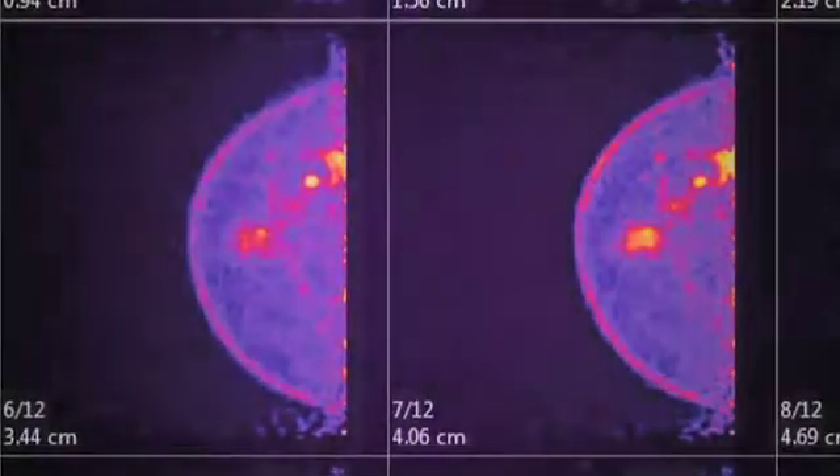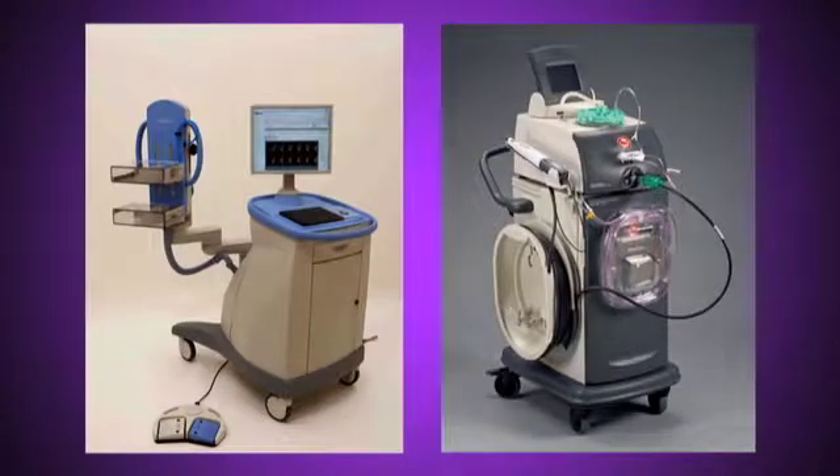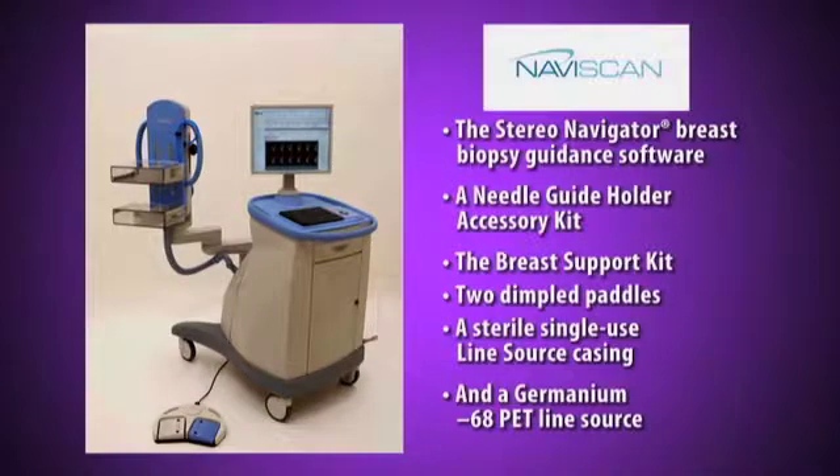To perform an image-guided breast biopsy with PEM, two sets of components are used: the PEM imaging components and the Mamatome breast biopsy components. The PEM components consist of the StereoNavigator breast biopsy guidance software, a needle guide holder accessory kit, the breast support kit, two dimpled compression paddles, and a sterile single-use line source casing.